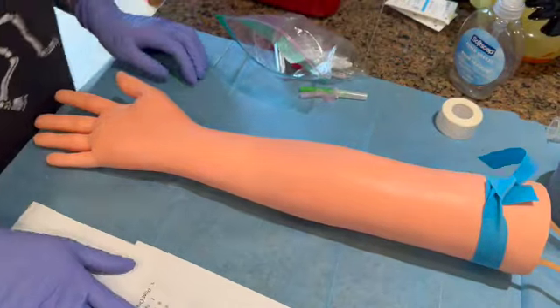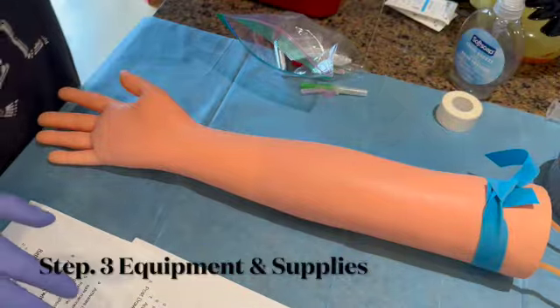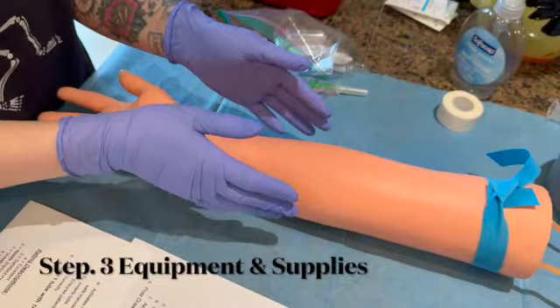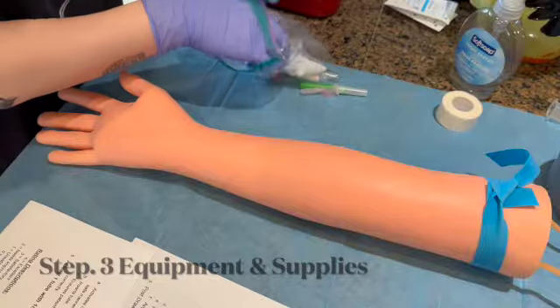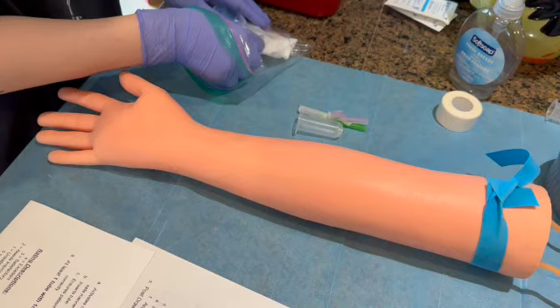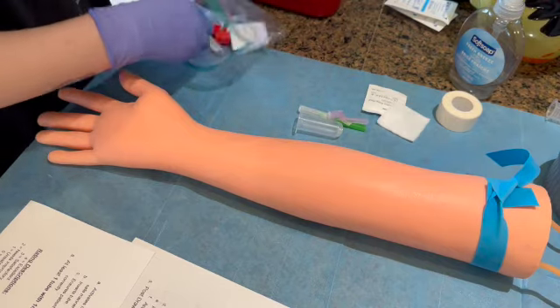And the next step is going to be step number 3, which is equipment and supplies. So we're going to select based on the anatomy of Robert here and the vein preference. We're going to select the appropriate equipment, needle type. We need tubes for that, and we need gauze, etc. So we've got our straight needle, our hub. I'm going to grab more alcohol wipes just in case, as well as my gauze.